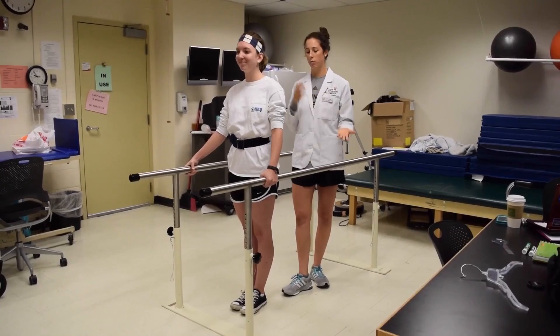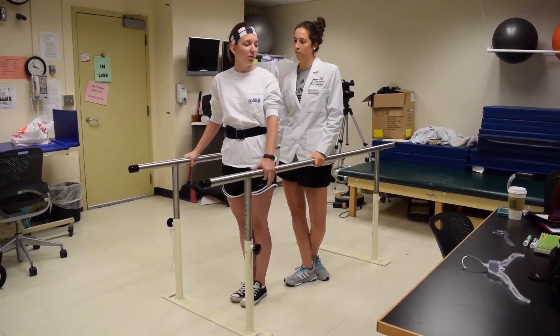I'll be seeing Courtney back and we will progress from where we were today. Do you have any questions before we finish up our session? No. All right, so that is all we have for the parallel bars. Thank you.